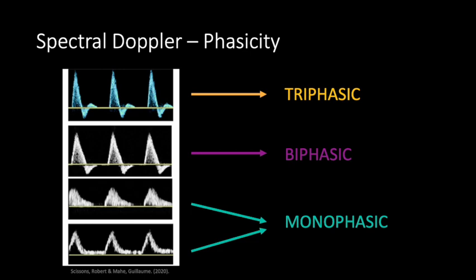The top curve shows a steep positive velocity followed by a quick drop and reversal of flow in early diastole with a return to positive flow in mid-diastole and no flow in late diastole. This is a classic triphasic pattern characterized by a waveform that crosses the zero axis twice, resulting in 3 distinct phases of the wave. The second curve is similar in that we have an initially high positive velocity and drop to negative velocity in early diastole, but after that, the curve approaches zero flow.